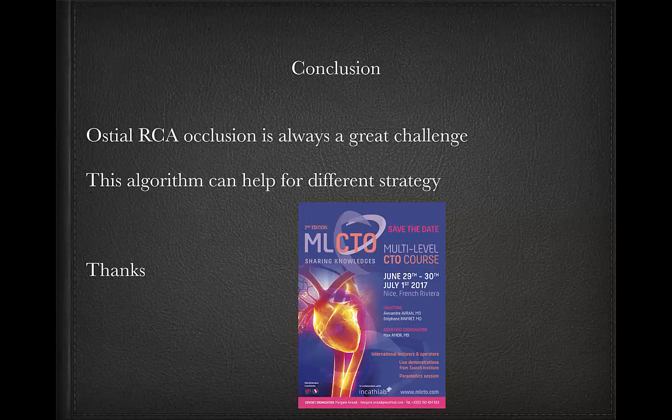So with these several examples, we can see that we can go antegrade in ostial occlusion. Sometimes it's impossible when you have no guiding support, so the only way is retrograde. But after retrograde, you can also snare or go inside directly the guiding catheter. Or antegrade, you can go antegrade only wiring, or ADR situation if you have good support. So that's what I want to expose to you today.